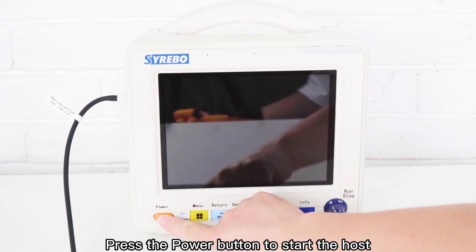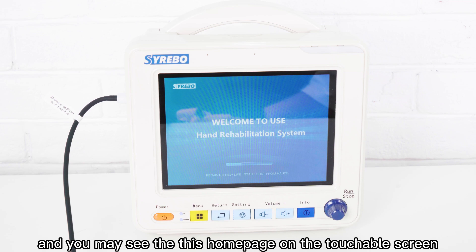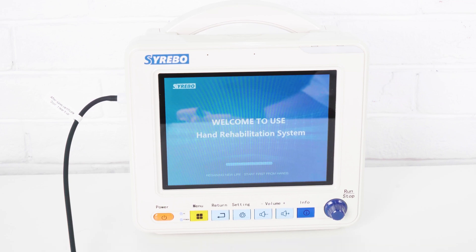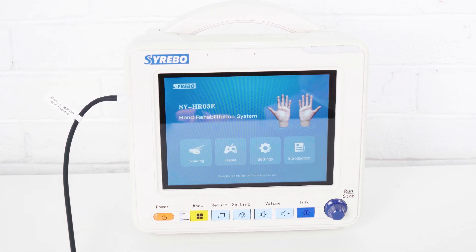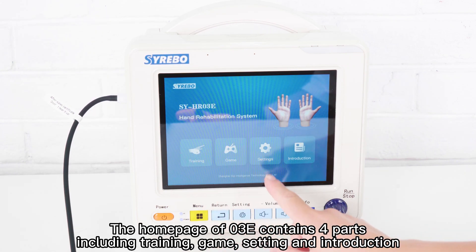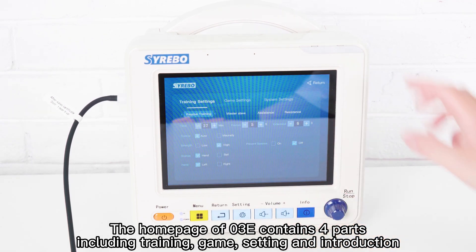Press the power button to start the host, and you may see the home page on the touchscreen. The home page of the O3E contains four parts: training, game, setting, and introduction.